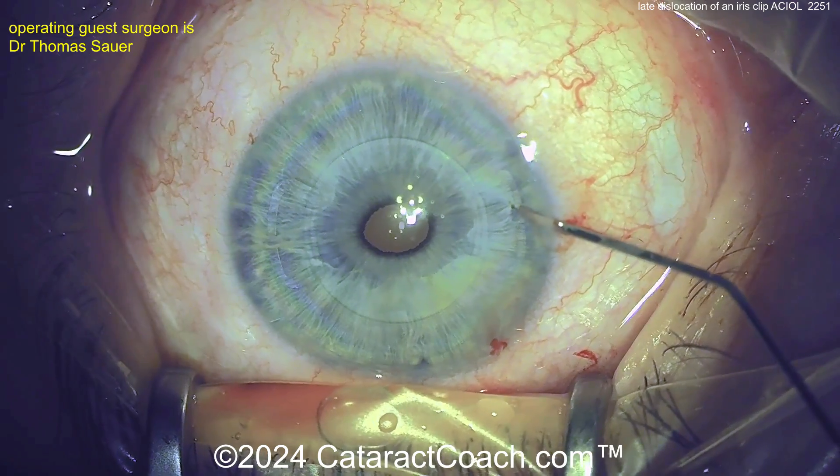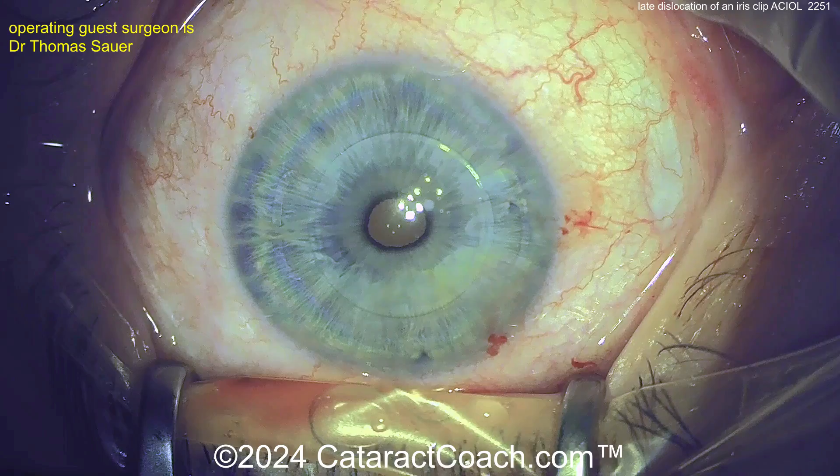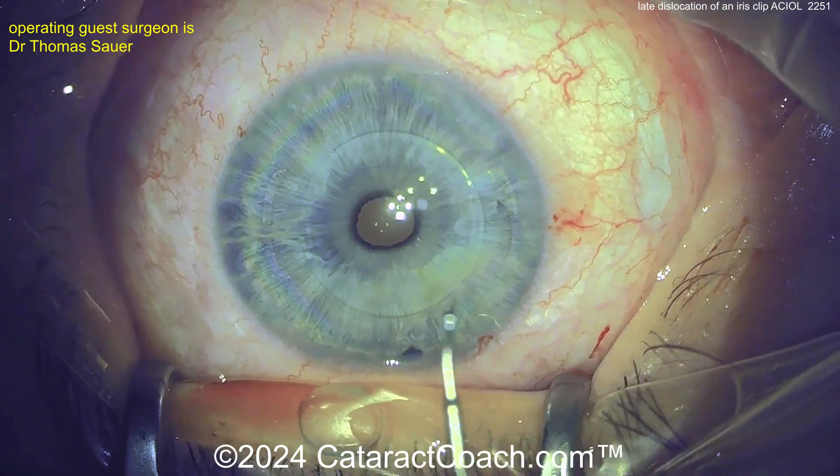Back to our case. A little more viscoelastic there. I like the position of the lens now — we've just got to get that iris captured in that claw on the right side of the screen.